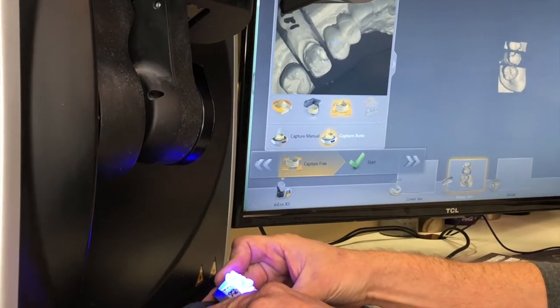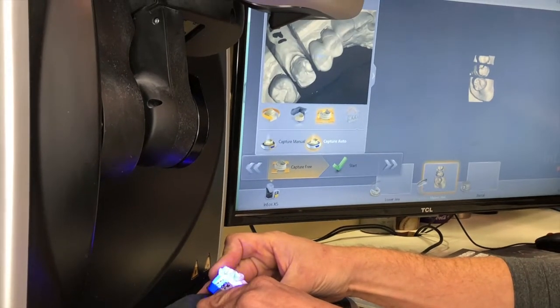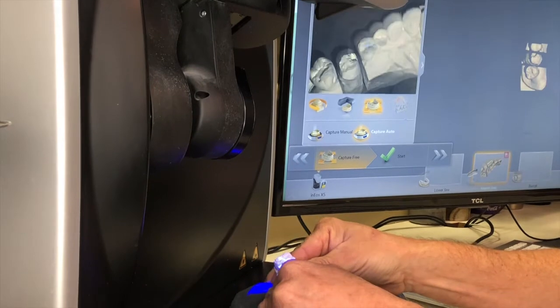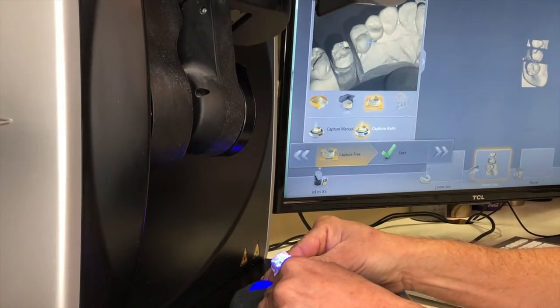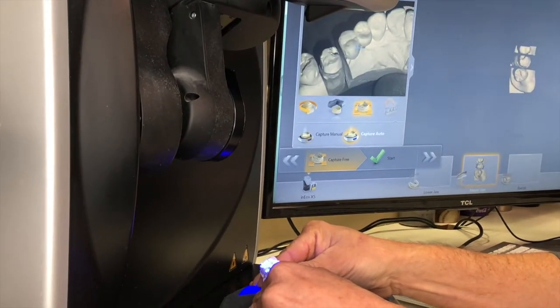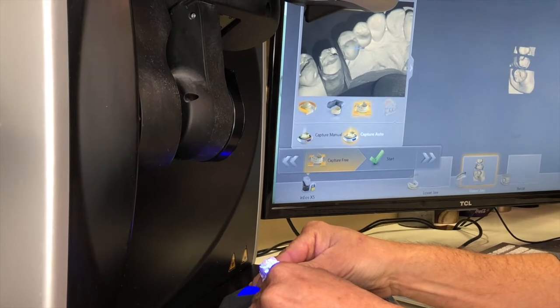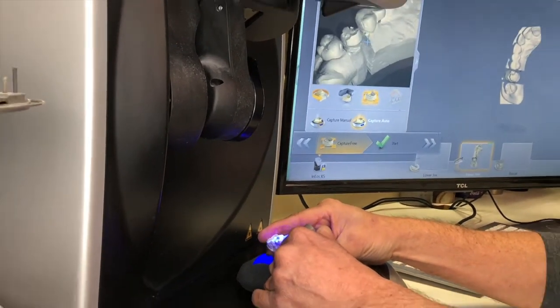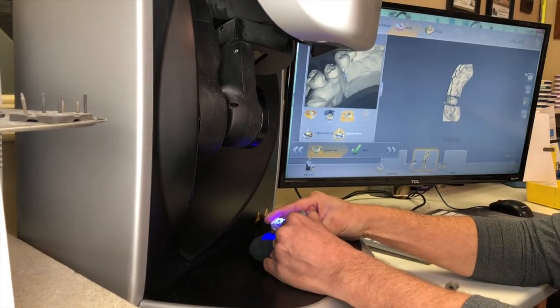I will take two shots of the occlusion — one of the facial and one of the lingual. As you can see, I don't have to repress the button because it will keep taking shots as long as I move it into a different position.